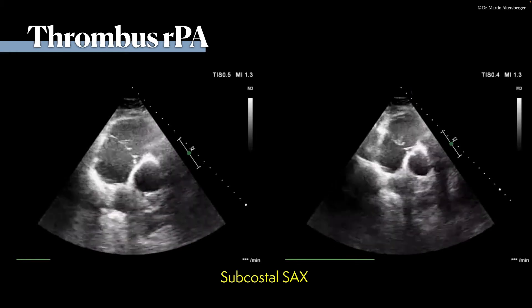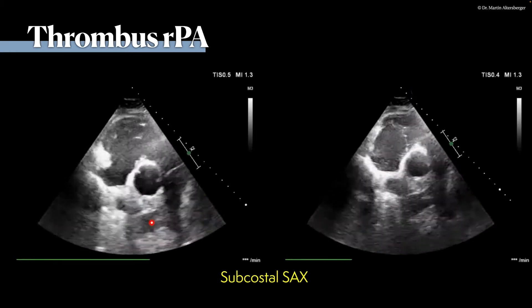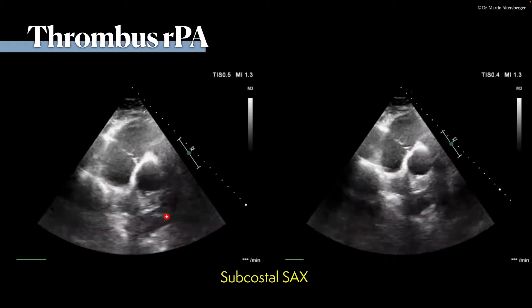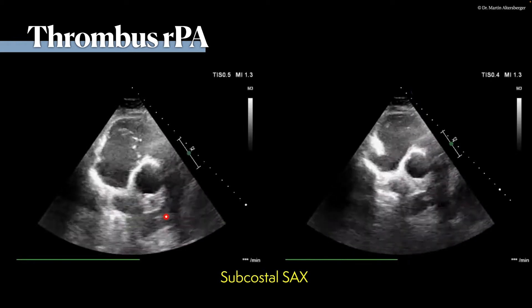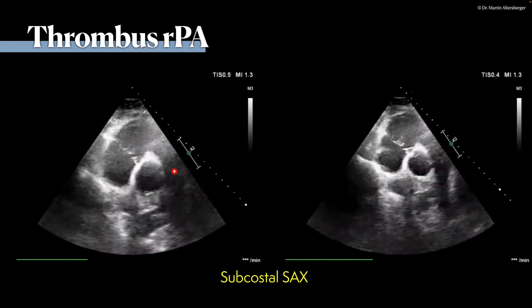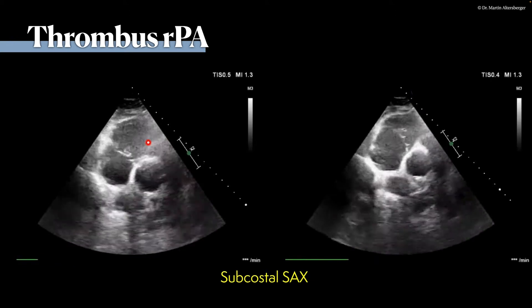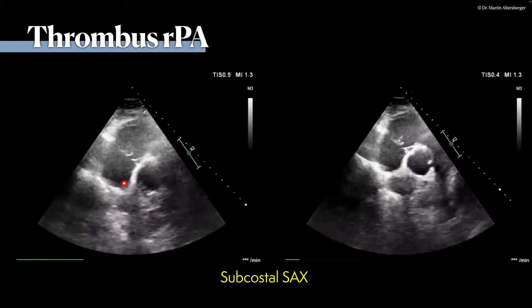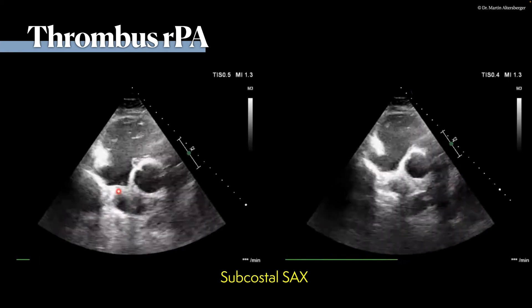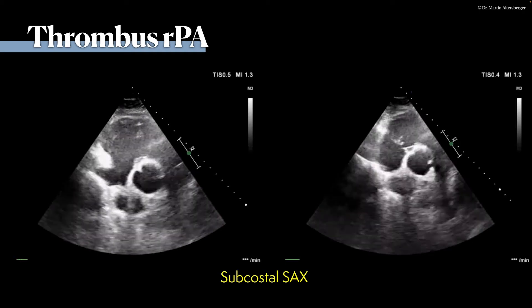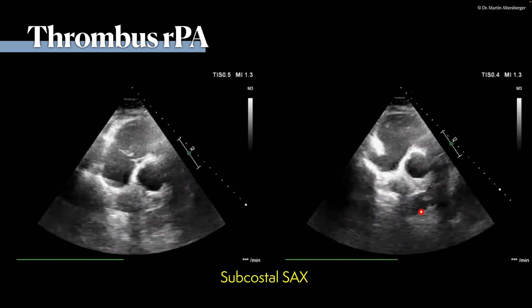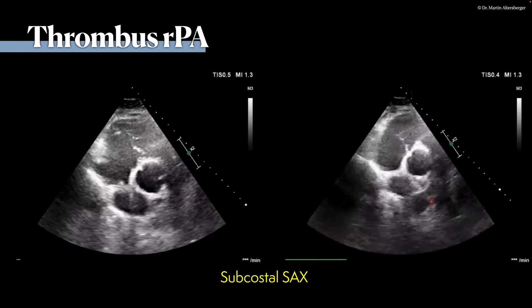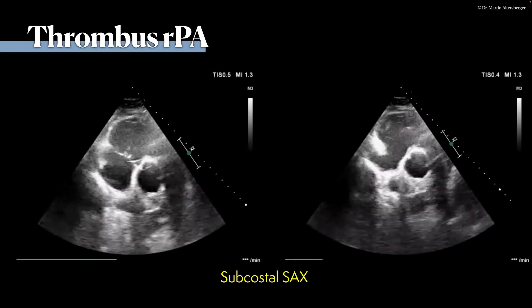Here are more examples where you can see a central pulmonary embolism. In this subcostal short axis view, we again have the right and left pulmonary arteries, and here you see the overriding thrombus, the pulmonic trunk, the pulmonic valve, the RVOT, the tricuspid valve, the aortic valve in the center, and the interatrial septum which is hypermobile. With more depth, it is even more obvious that there is a central pulmonary embolus.